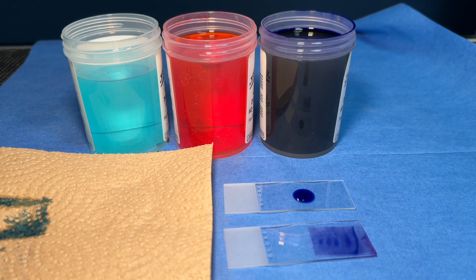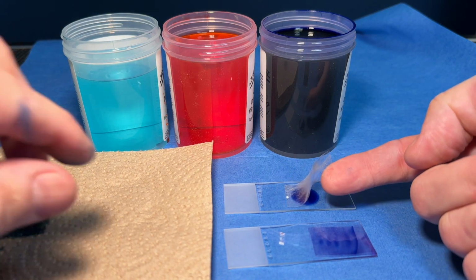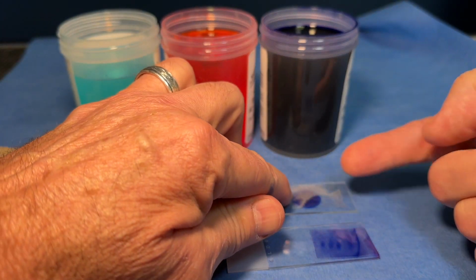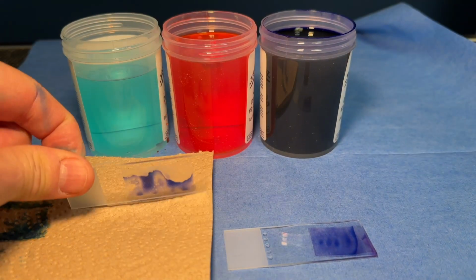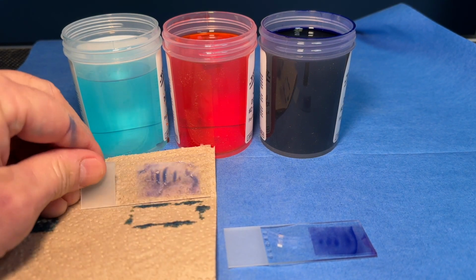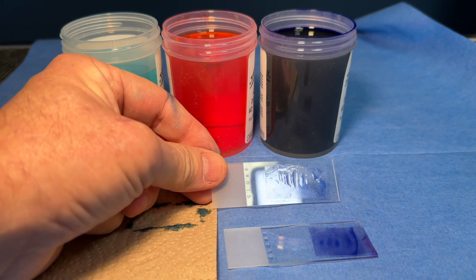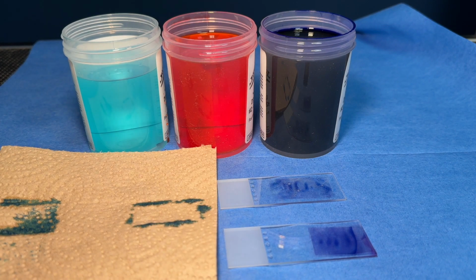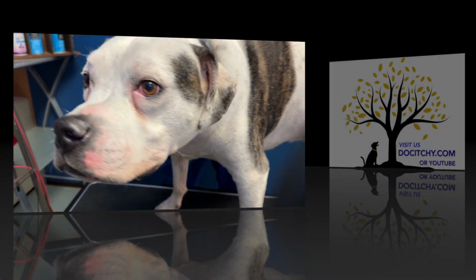The third stain in the DocItchy 3 set actually is all that's needed to stain all of the bacteria, Staphylococcus, the yeast, and the white blood cells that we need to observe for most dermatologic cases. The tape can be used to collect the sample, and then a drop of the third purple stain applied to the slide and the tape pressed on top. The excess stain can be dabbed off by inverting the slide on a paper towel to remove the excess stain. The slide is ready to be examined under the microscope, and we'll find out what infection Petey has.